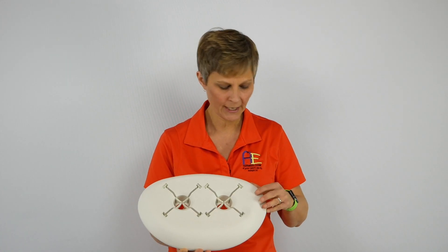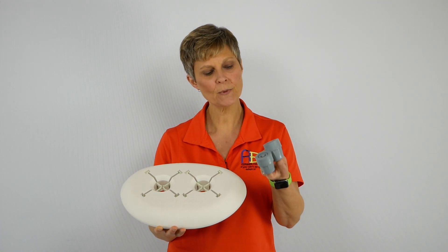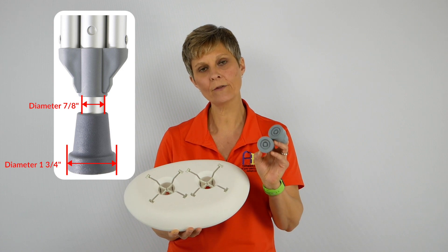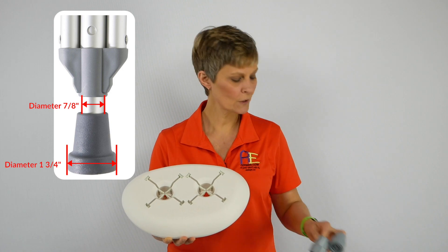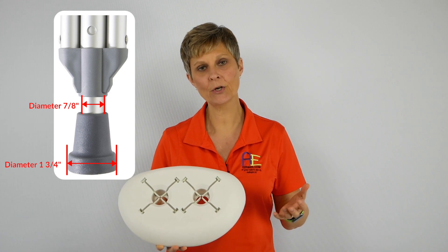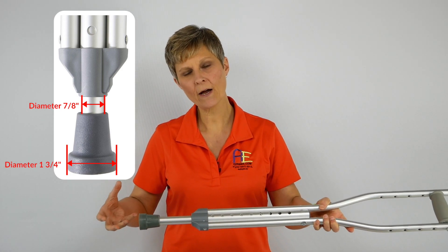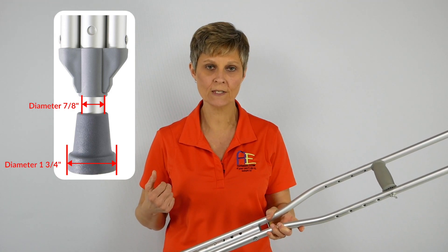In the box with the Crutch Caddy, they also include two crutch tip ends. These are specific sizes for this crutch caddy — the diameter is one and three-fourths inches, which will fit right into the crutch caddy. Most crutches made or used in the United States, the axillary crutches — the ones you use underneath your armpits — will typically be that size. If the end of your crutch is worn out or the tip is not very good, it may not work well, so you may want to substitute it with the ones they've included.